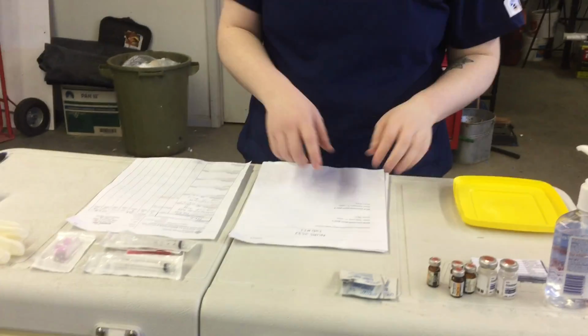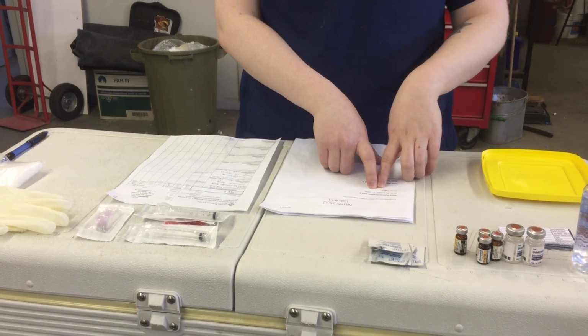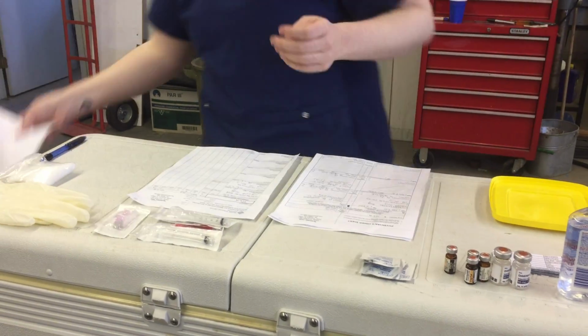I'm a University of Manitoba student nurse, and today I'm going to be demoing a subcutaneous injection. So the first thing I'm going to do is look at my scenario here. We have med demonstration part 1. The date is February 7, 2021, and the time is 08:25, and we're going to be administering medications this morning.